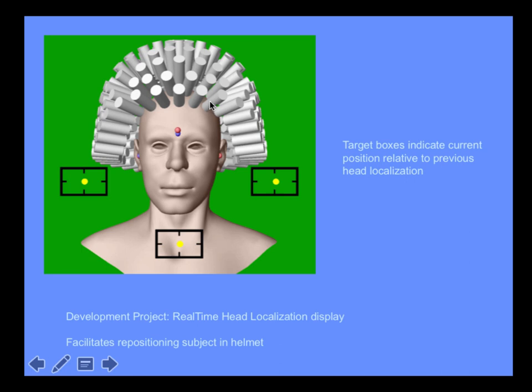Although this looks a little cartoonish, this is absolutely accurate. This is a CAD CAM drawing of our coils. Okay, and we won't mention who that is, but that's a surface peel from that person's structural MRI. So although like I said this looks cartoonish, this is actually very real relative to the data and the coordinate system.